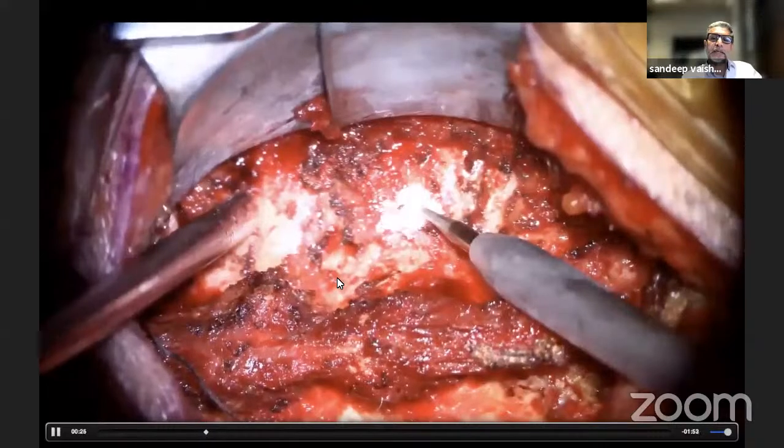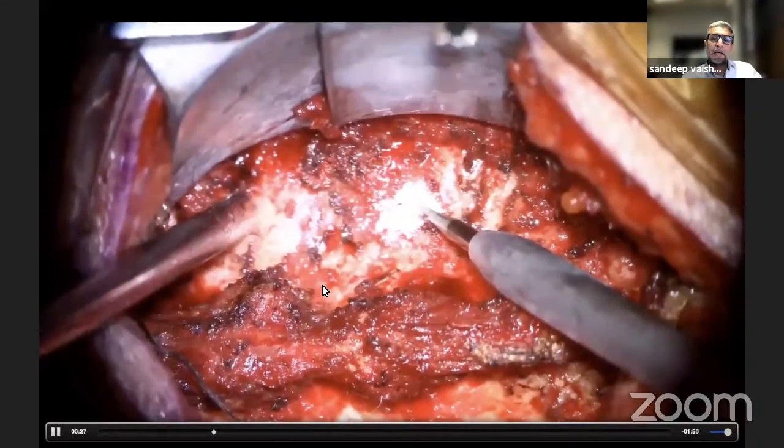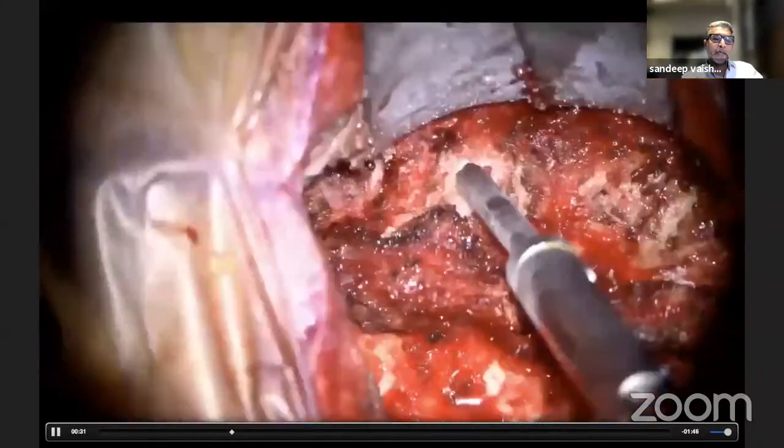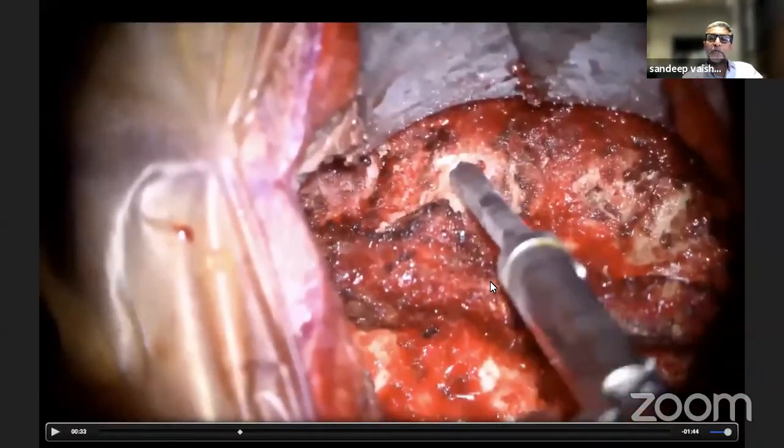So with the drill, I decorticate and then enter the drill. And up to 8 to 10 millimeters, I do with the power drill. And then, as you can see here, I'm using a handheld drill. I take it right up to 14 millimeters. And after that, I take it forwards in increments of 2 millimeters till I break the opposite cortex. Usually I don't tend to go beyond 18 millimeters. So even if I have not broken the cortex till 18 millimeters, then I stop there.